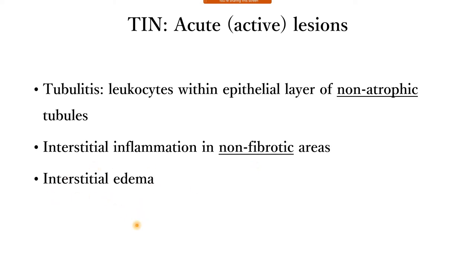Interstitial edema is very important because sometimes a patient has really minimal inflammation, but still we do see prominent edema. We think, here's something weird. Then we need to go deeper, or we need to look at other tissue. Then eventually, often we can find the inflammation. If we see edema, it is abnormal, kind of a warning sign.